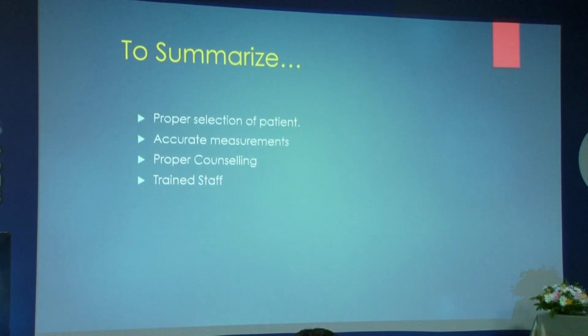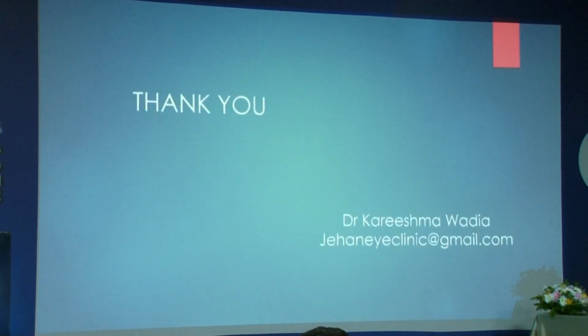You need to take accurate measurements, so don't compromise on doing manual measurements versus optical scans. Proper counseling is very important, and it is also important to have trained staff to help you with all this. But the ideal thing that you should remember is, for these patients, because they are not going to come in volumes as much as your other patients, make sure that you step in and take these measurements yourself if possible. Thank you very much.